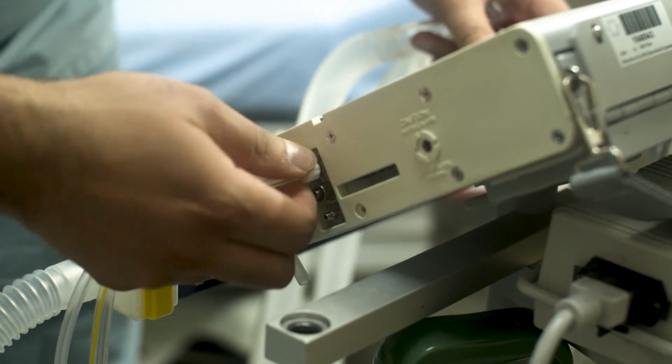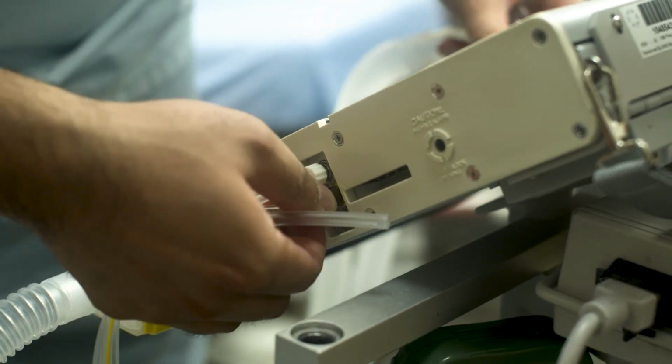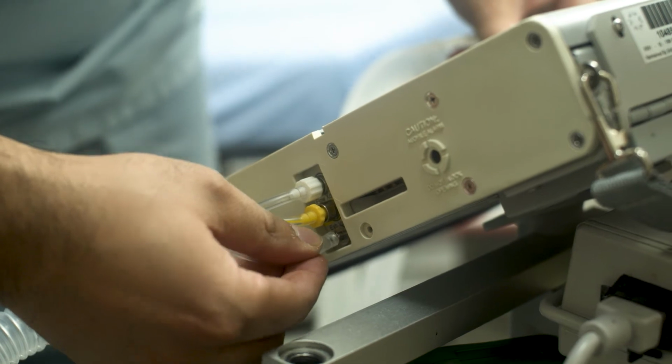One is white, one is yellow, and one clear, and the receptacles are color-coded to match. They also have a male, female, and simple push-on ports, so it's fairly impossible to insert them the wrong way. Insert them tightly. The thick white tubing from the left side of the ventilator is for oxygen delivery.